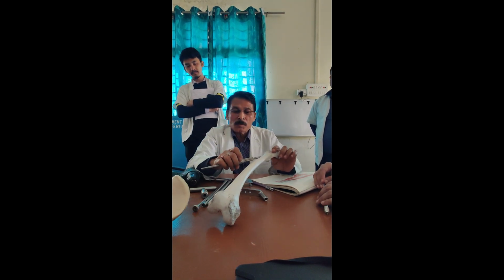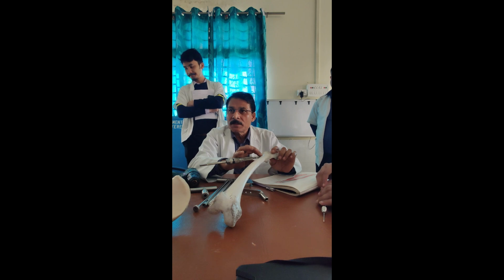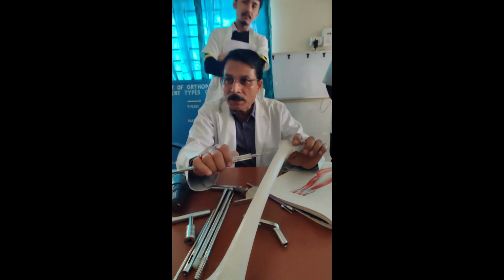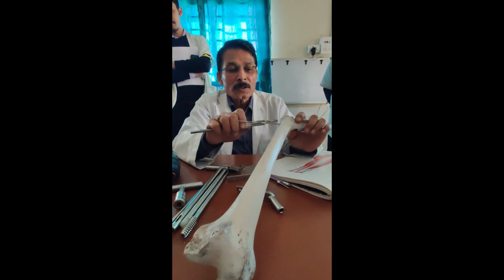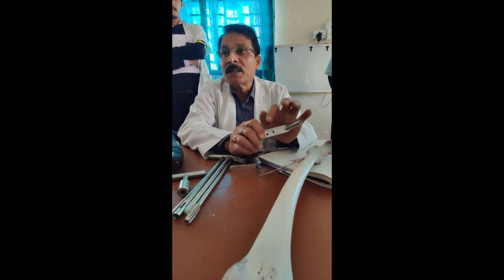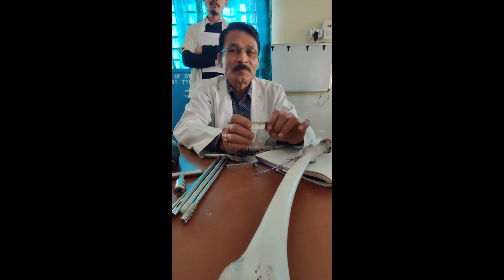Then this part is supposed to flush with this. This is important, because if you are reaming up to this level and this hole is not big enough to accommodate this part, then it will lie outside. It is not going to be accommodated. Correct? So that is why reaming is a must.